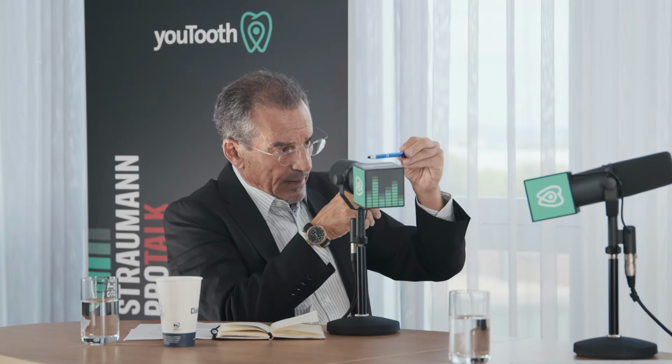So the principle for the zygoma is, please don't destroy the alveolar bone. Be conservative. This is what we call ZAGA minimally invasive osteotomy. You have to place the implant with the posterior part of the platform supported either by alveolar bone or by palatal bone. But that said, we are totally against those philosophies that say your first action should be to destroy the alveolar bone and then get anchorage up there.